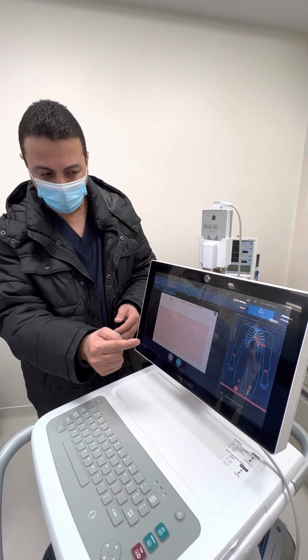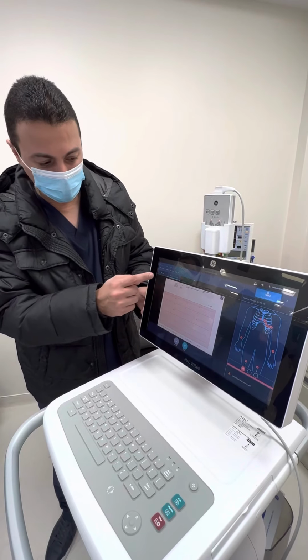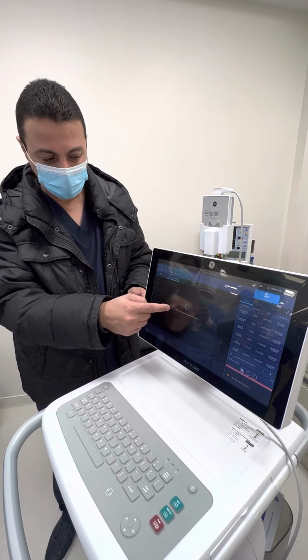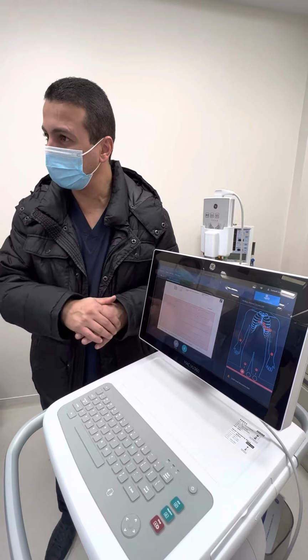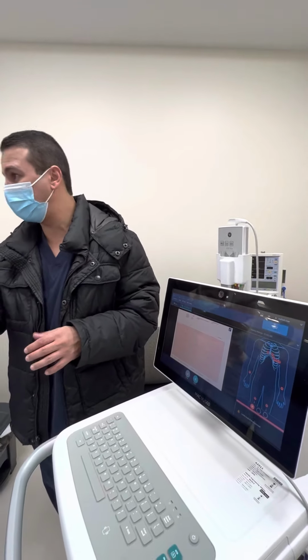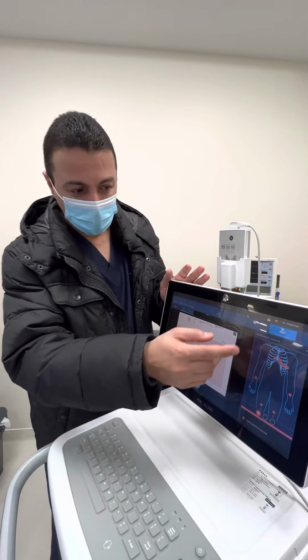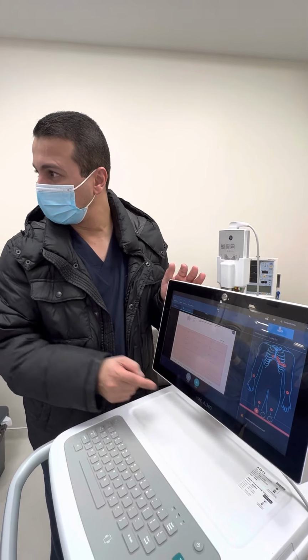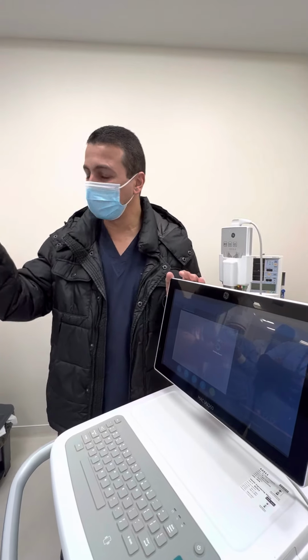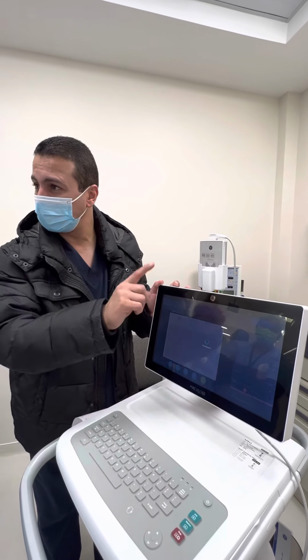okay? Acquire your ECG, you like the picture, accept, then transmit, or you can do live, check the signals again, acquire, start ECG. It will keep it on the system here, or it will override the previous one, then upon the right report, you will accept, you will transmit, it will be in the patient's profile. Okay? No order for our patient: it will be just do the ECG for your patient, do the right management, then place the order. I did accept, sorry. So place an order in the system, get back to your machine, get back to your reports here, attach the order to it, then transmit.